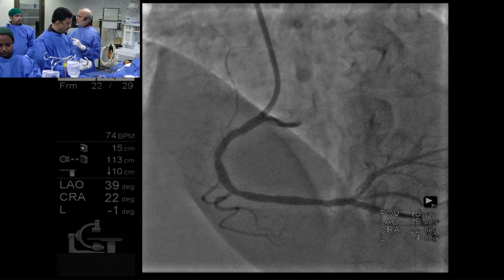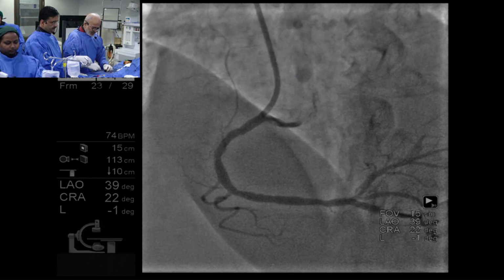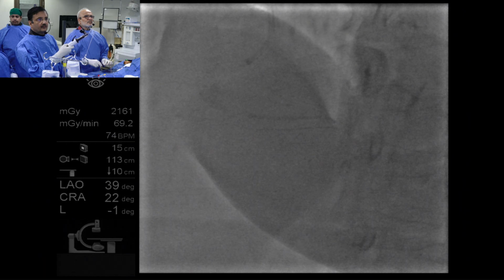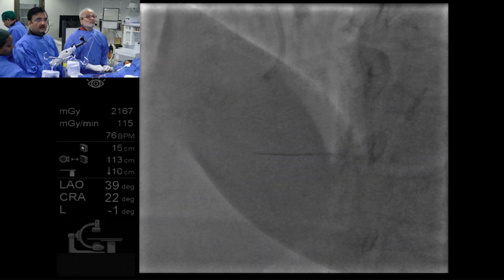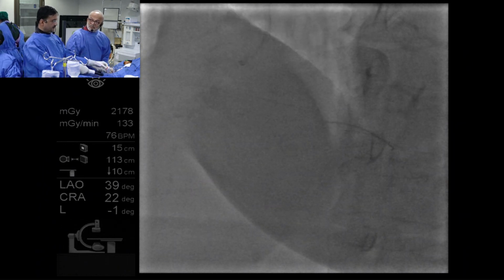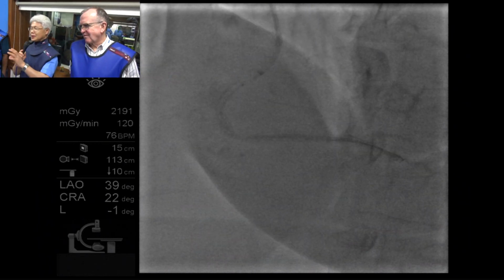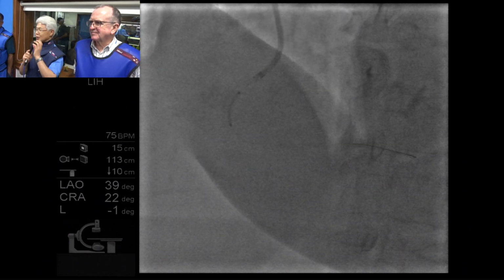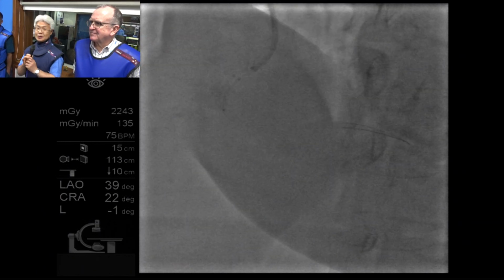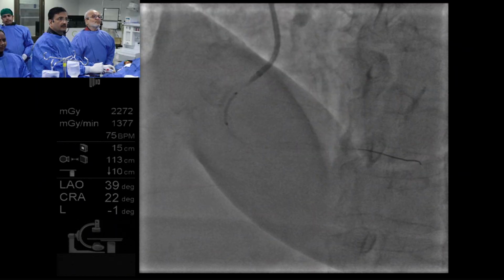Dr. Saito said this is the perfect size. OCT run. Yeah, I think still there are lots of discussion about the calcified nodule, right? If we put a stent and if there are lots of protrusion, there is high risk of restenosis. Therefore, in Japan, one study is going on using a drug-coated balloon to avoid the restenosis. We are not sure of the final result, but leave nothing behind might be one of the options at the site of the calcified nodule.